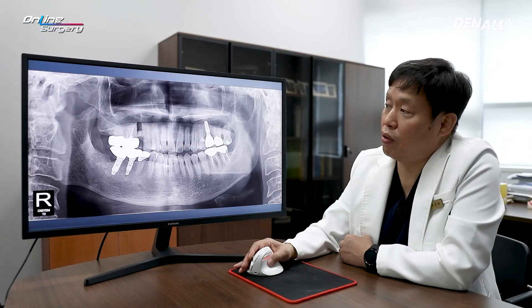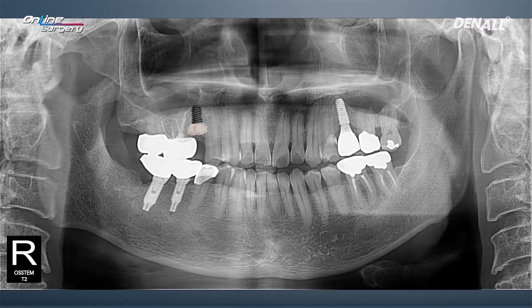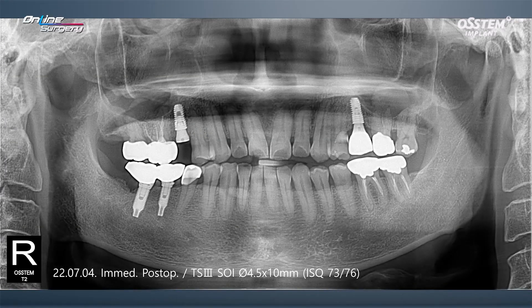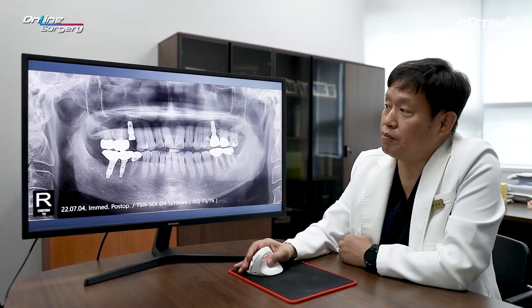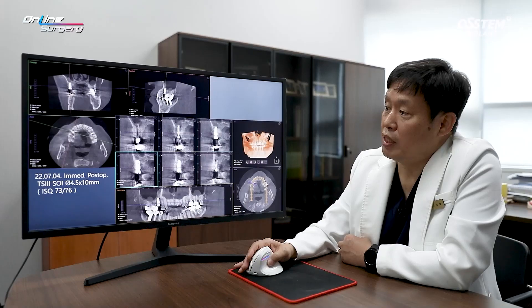This was how the surgery was planned and conducted. The implant was placed and bone graft was done on top. Because there was no buccal wall, additional bone graft was planned. This is the immediate post-op image. A TS3 SOI surface, 4.5 by 10 mm implant was placed. At the time, the ISQ was 73 and 76 — it was comparatively favorable.